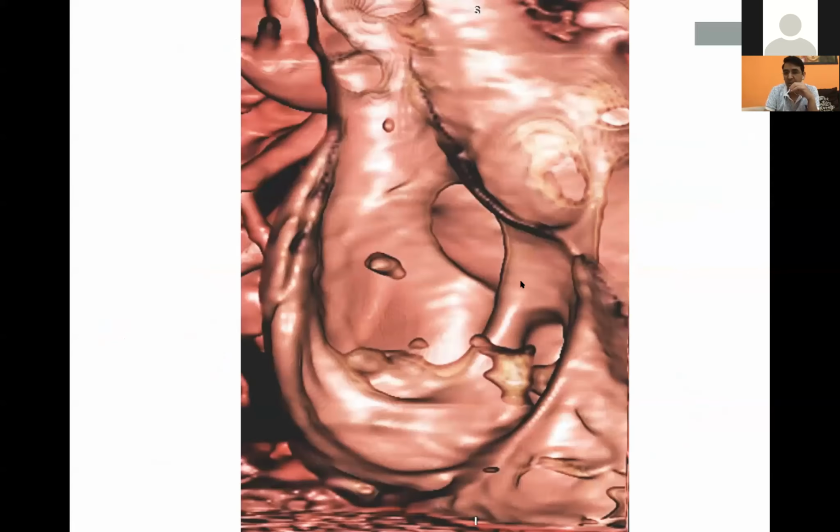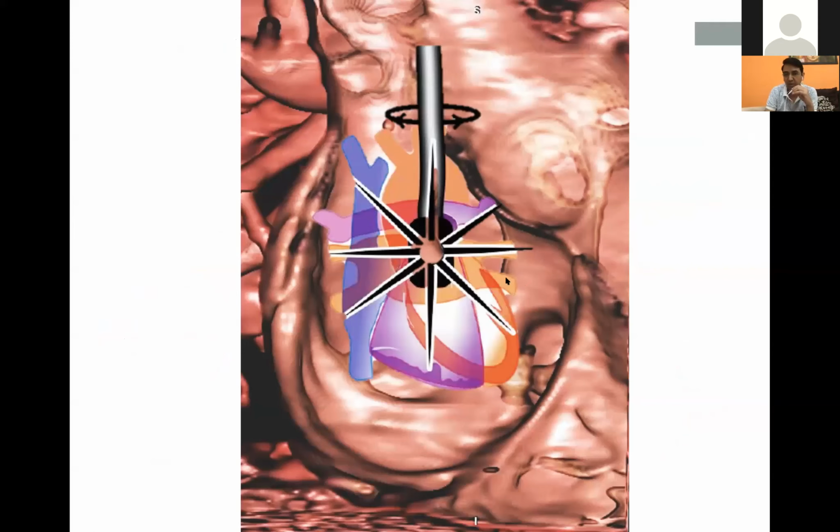Now again, the same image, I will just superimpose this TE probe onto it, and then you will realize what I mean. This is the 0 degrees, and you would see that this is the mitral plane, and this is the posterior lateral opposite to that. This is the 45 degrees. So we see the retroaortic and the inferior posterior area in the posterior aspect. Bicaval view, and you will realize why we don't see the IVC. I'm emphasizing it again and again because that is very important. We should not mistake the eustachian valve for IVC whenever we are imaging this.